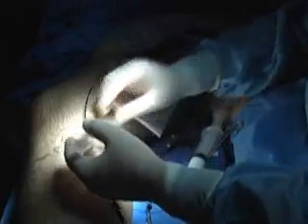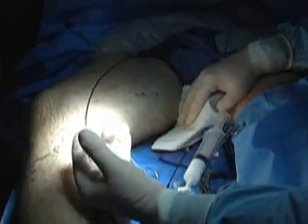The computer back there has a monitor on it. If we come to an area that's large we slow down or we'll treat it two or three times. If we hit an area that has a big branch we'll treat that two or three times so that it will close it down completely. Pull back time is about 15 to 20 minutes and the total surgery time is about an hour and a half.